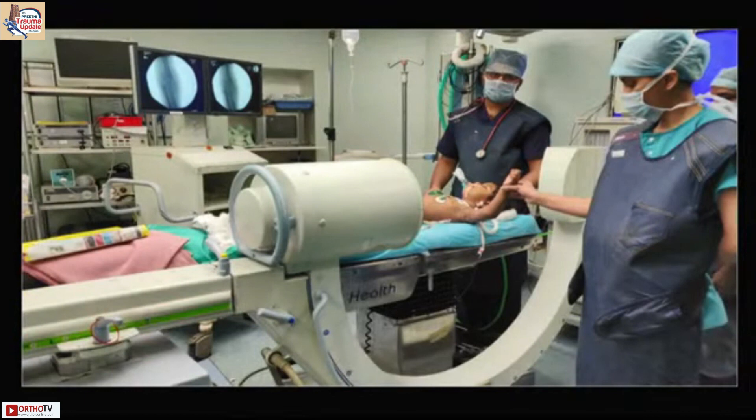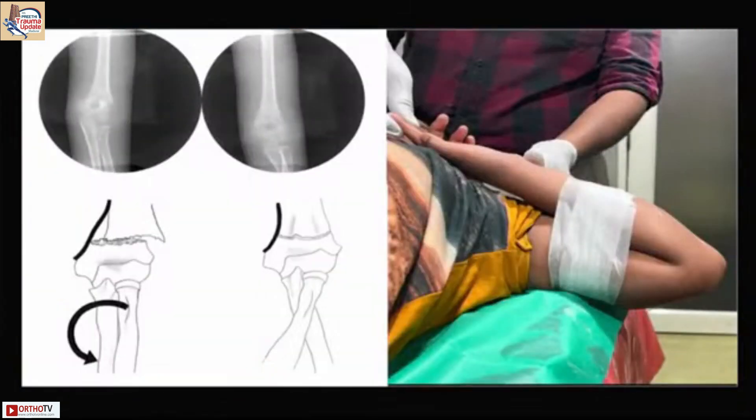Once you are done with that, I generally put a tape and then our assistant holds it in a flexed position. The position of the forearm depends on the direction of displacement.